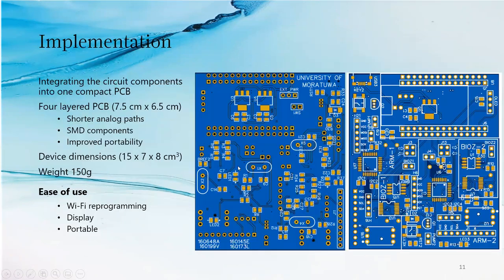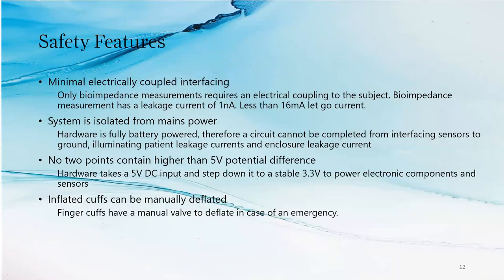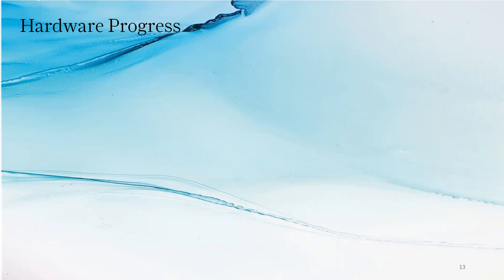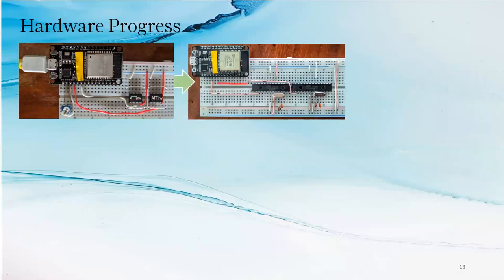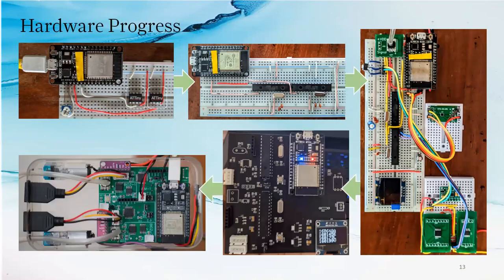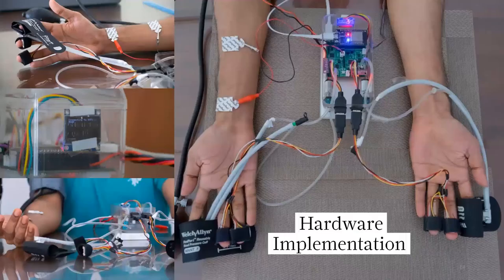The system is implemented on a small 7.5 cm by 6.5 cm four-layer PCB that has a few surface mount components. As it's a medical product, there are several safety features such as electrical isolation and emergency valves that are used to maximize the safety of the patient. We went on a very long journey with a lot of twists and turns in creating the system. This is a glimpse of how we went from a breadboard to our final circuit.